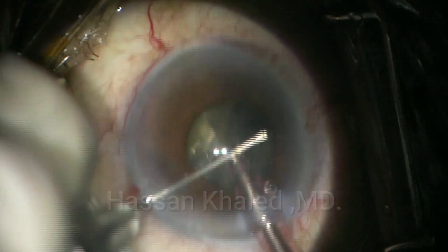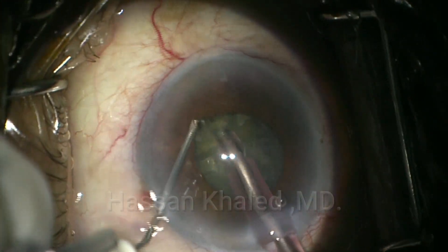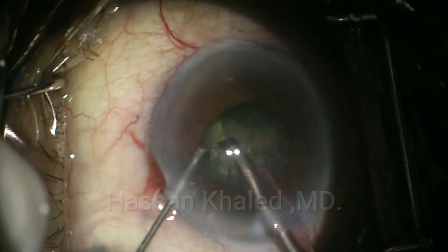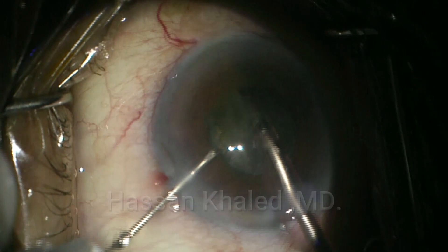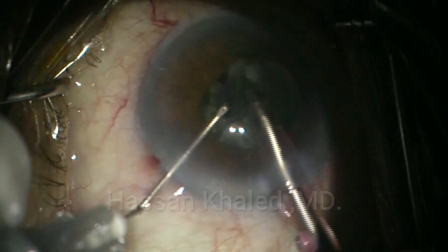You can repeat it more and more as you can see. By the end, you can see the nucleus has been chopped into smaller pieces, similar to pie pieces. Then you can hold each smaller piece and emulsify it supranuclear at the level of the pupil as it's clear.